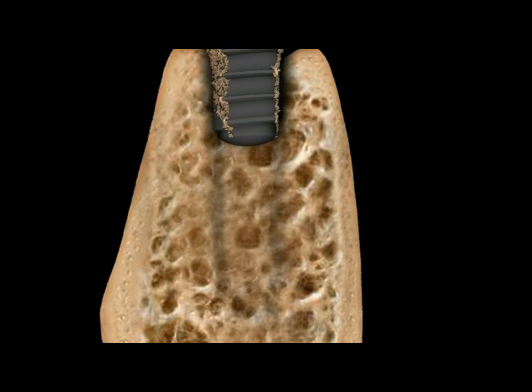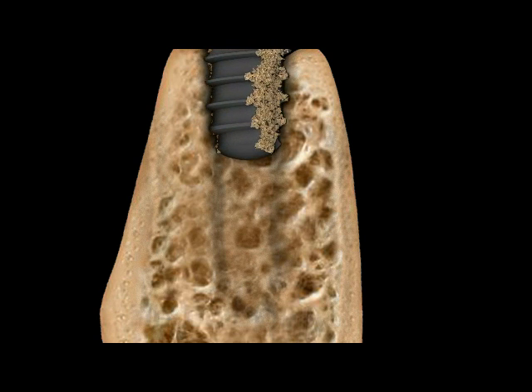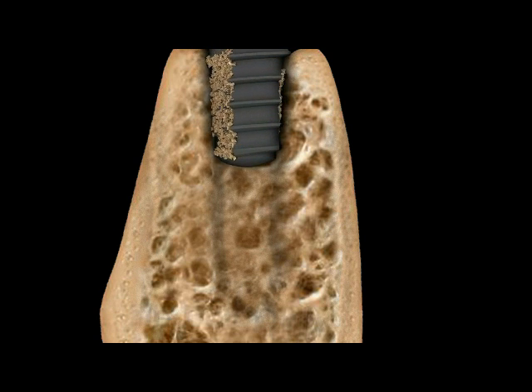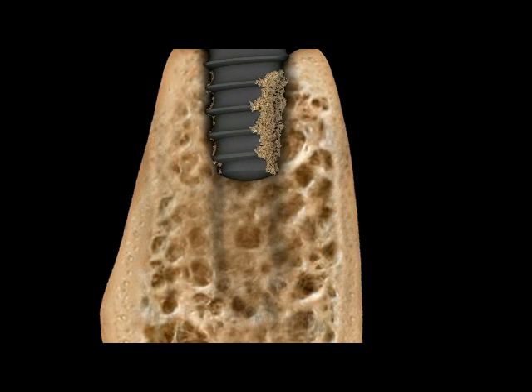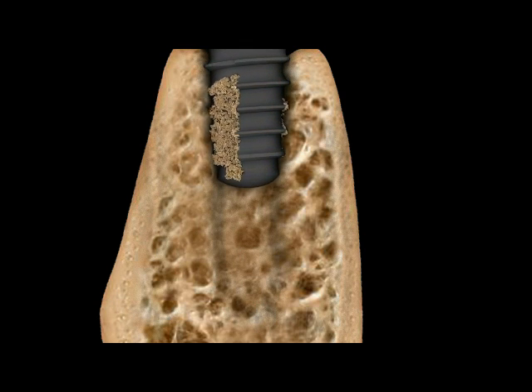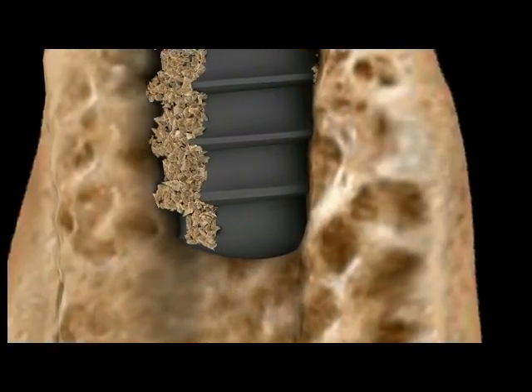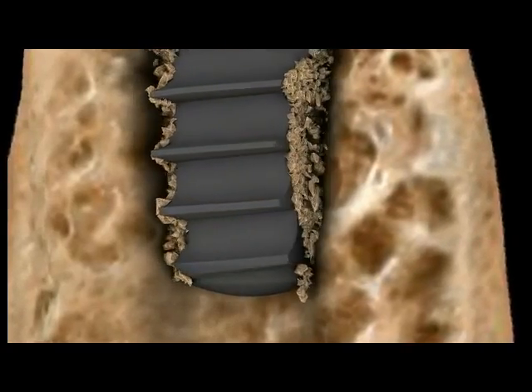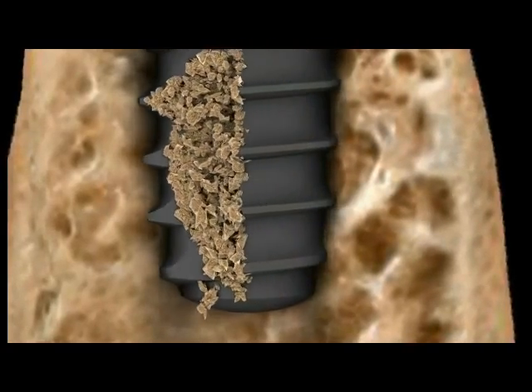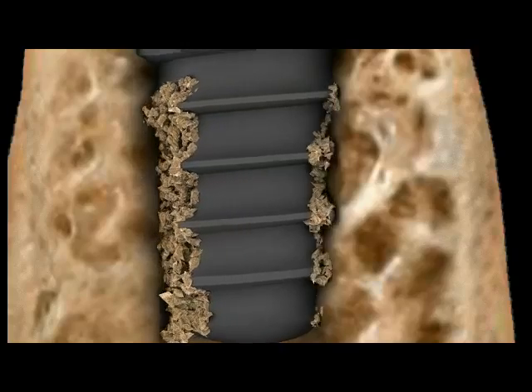You're watching the seating of a conventional self-tapping dental implant. As the implant is turned into the bone, the tapping segments continuously fracture off bone chips. These chips accumulate in the flute. This buildup is called crowding. As the implant is seated, crowding clogs the tapping areas with debris, reducing cutting efficiency. When clogging is maximum, high compression occurs on the untouched threads.